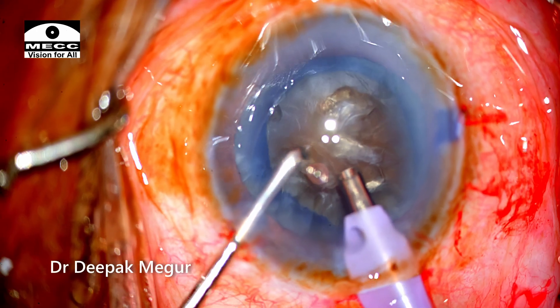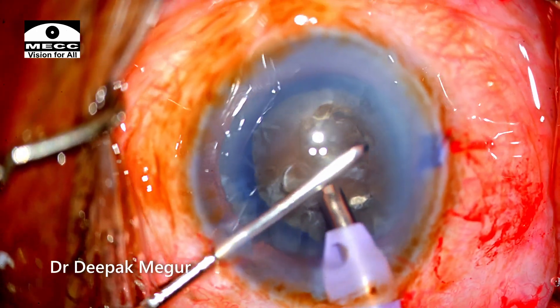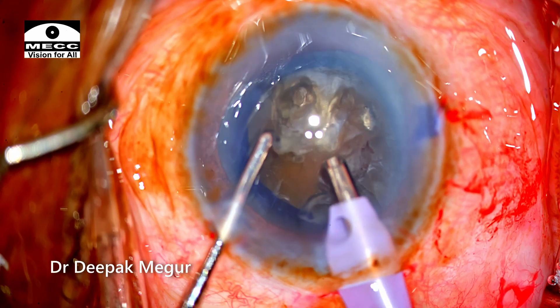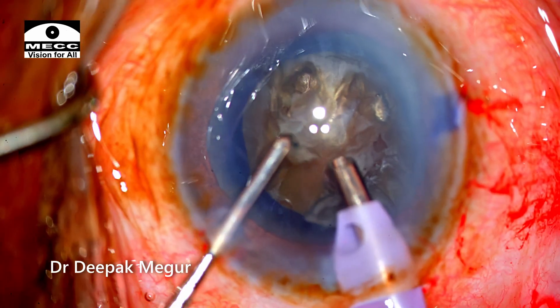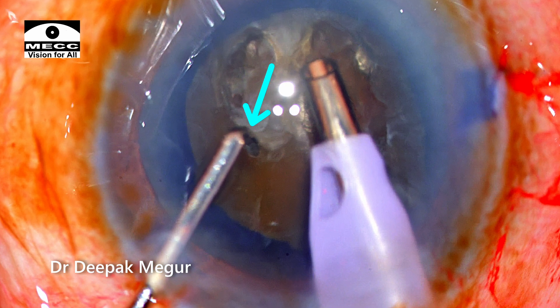The nucleus management part in this video is mostly unedited or minimally edited, so it is going to be a slightly long video, but one can observe the difficulties throughout the process. The phaco tip is slightly more exposed than I usually use, and I am also using a long chopper to provide extra reach.